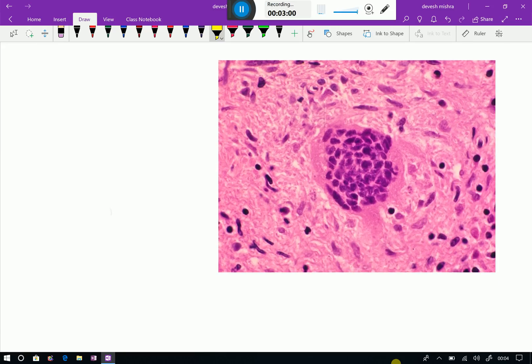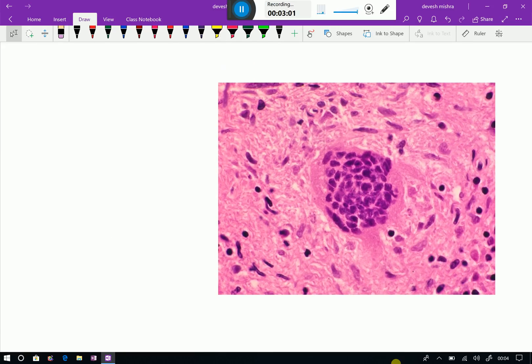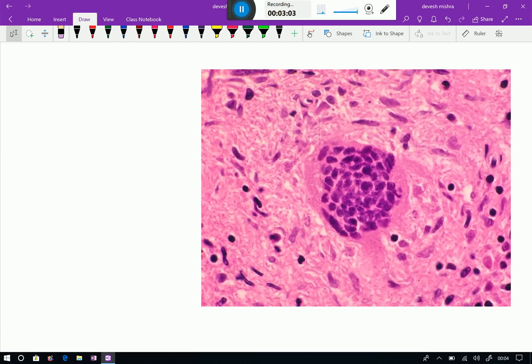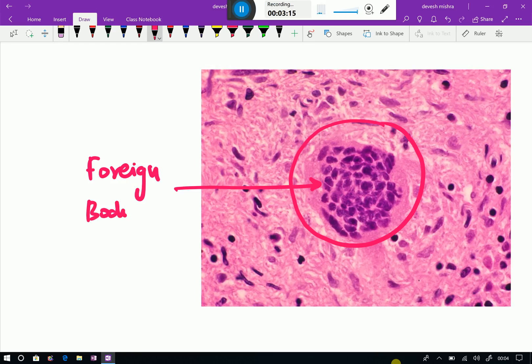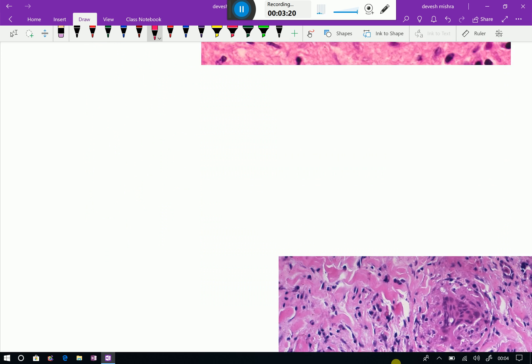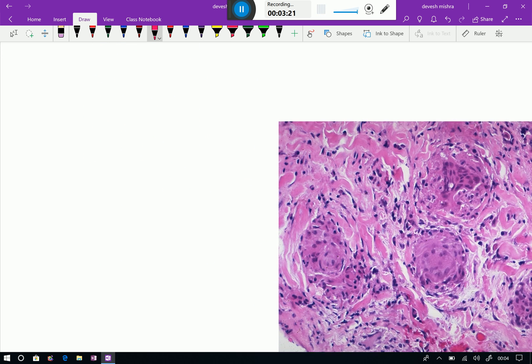As you move to the other areas, you will observe certain cells. Here again there is a different kind of giant cell — you can see the arrangement of the nucleus is haphazard. So this is a foreign body type of giant cell.